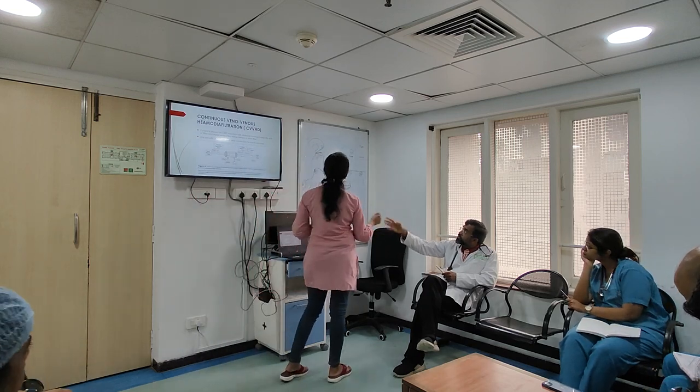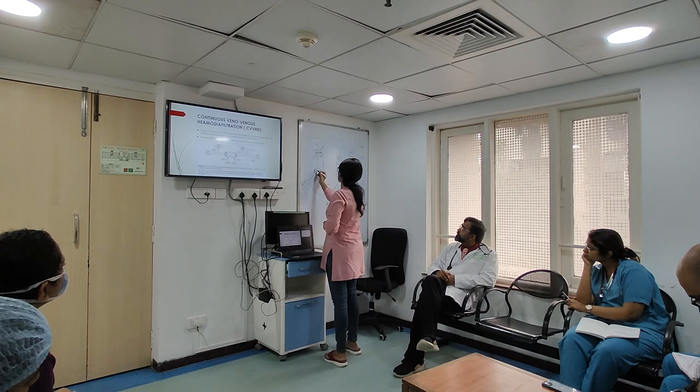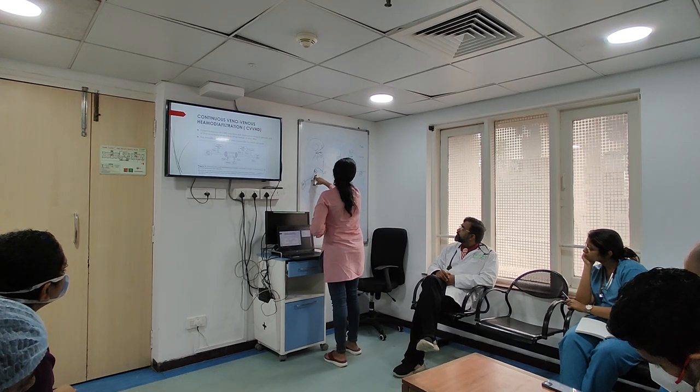What you want to add on this, not to complete the entire thing, to CVVHDF, what do you want to add? First, here we'll be having that replacement fluid pump.